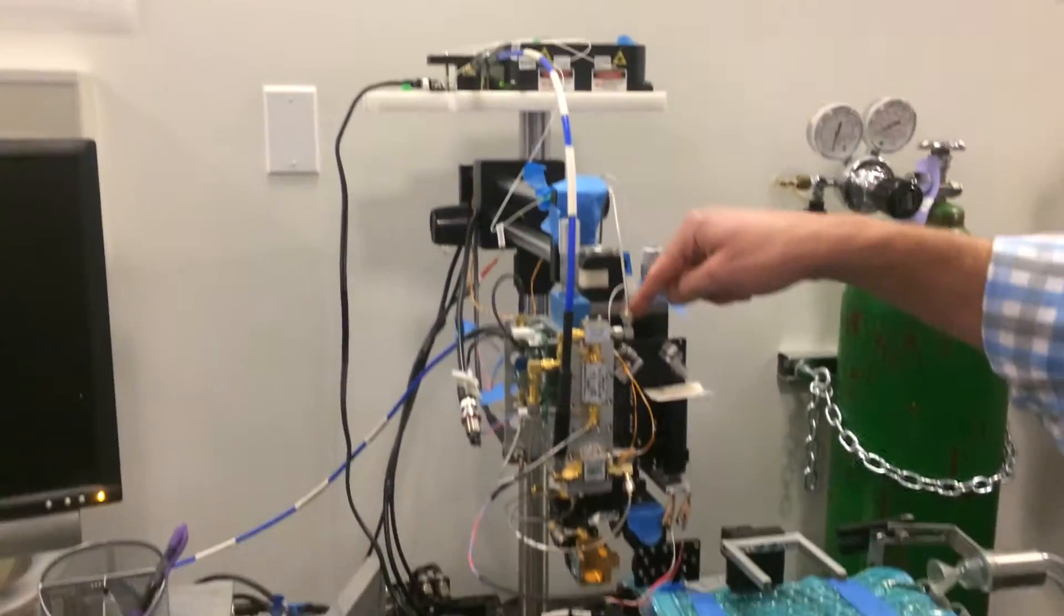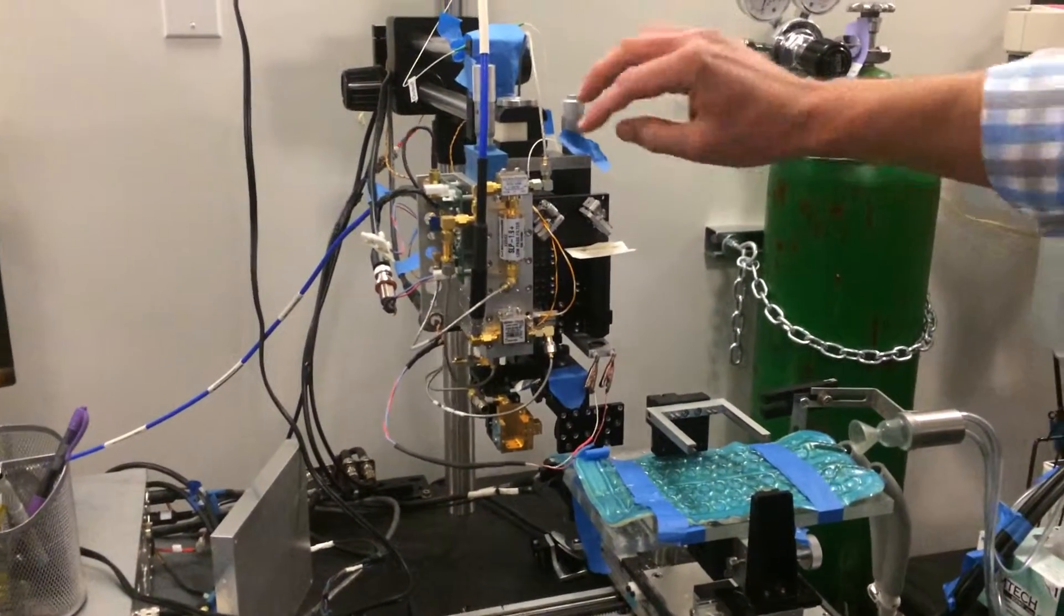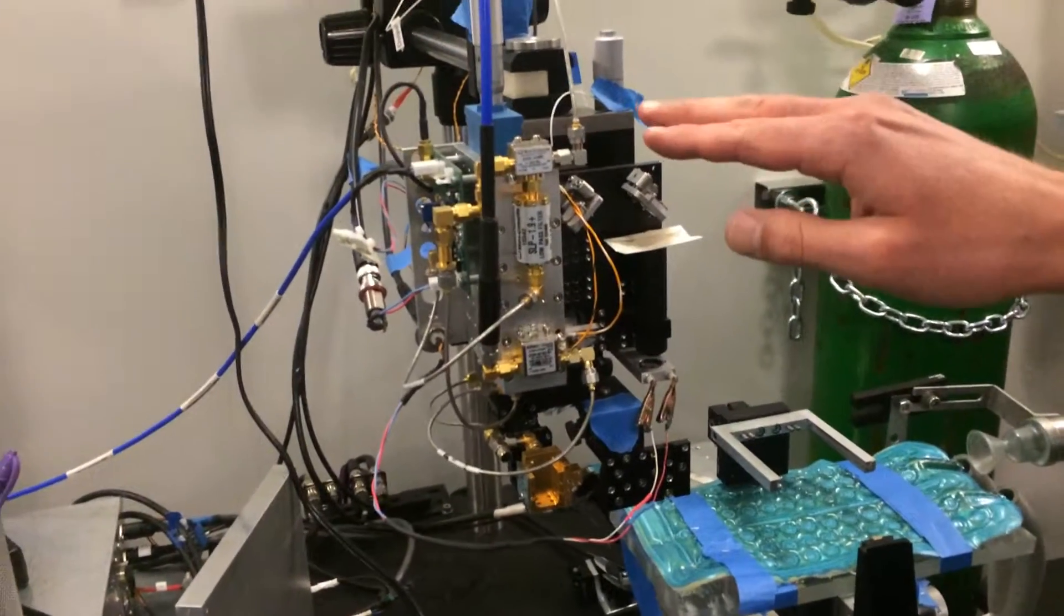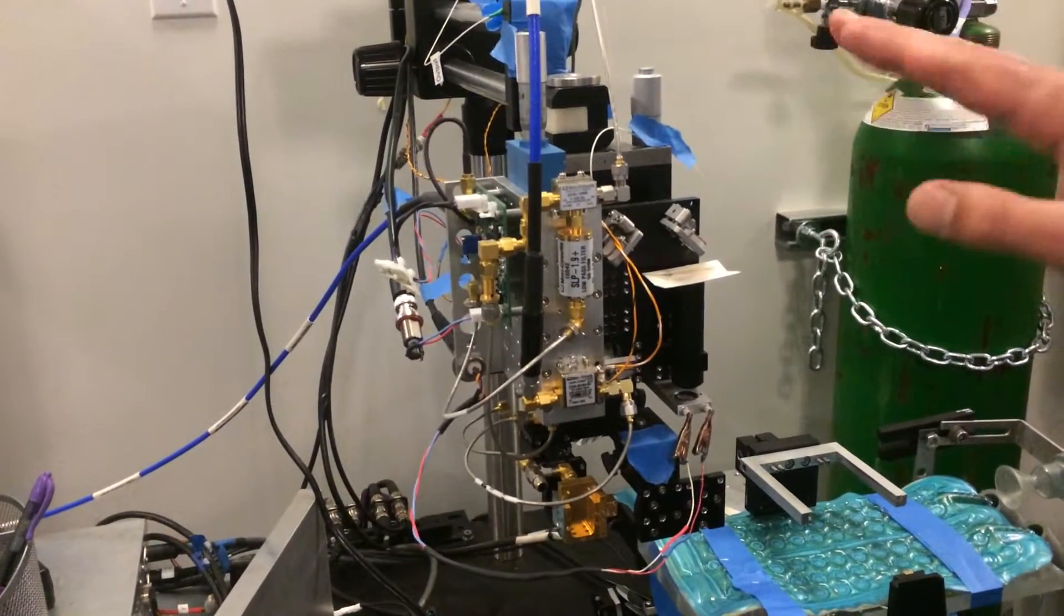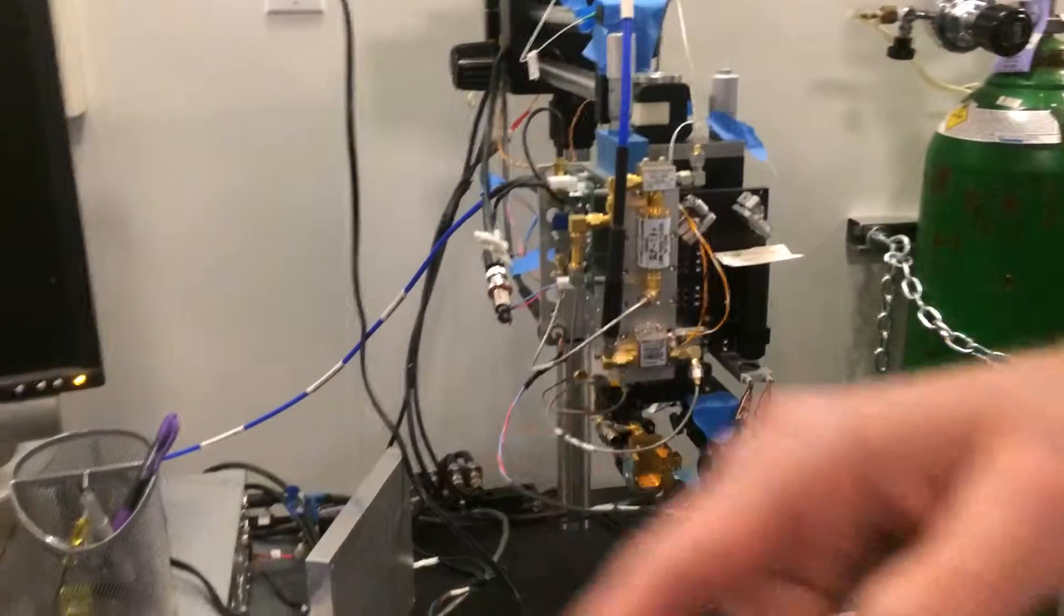1560 EDFA, and then it pumps the PPLN down here. Then we have 780 free space output coming through here. We have this piece here that we've designed with a bunch of free space optics. Part of the reason for the free space optics is to route it down to the lens, nice and collinear with the optical axis.